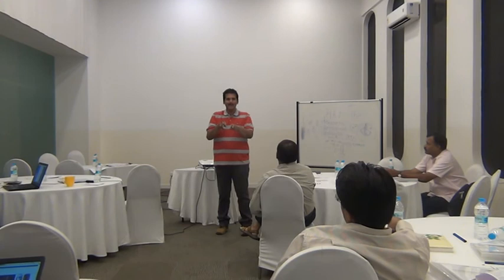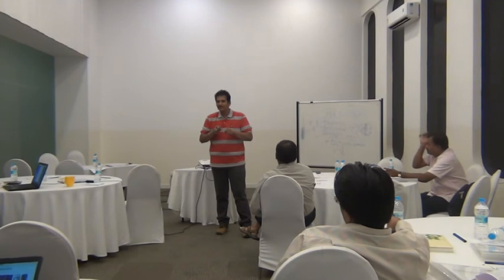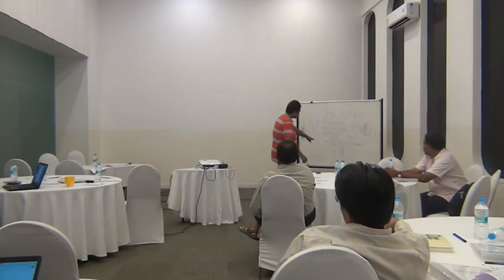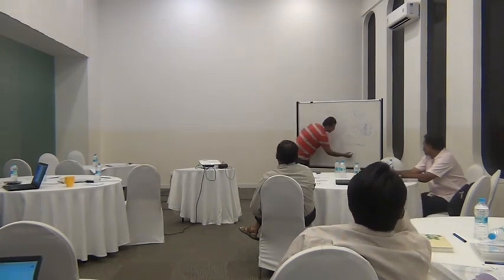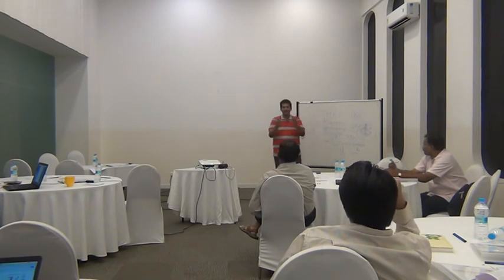Suppose there are two cars going in a race. One person is very hungry, another person is having a burger. The person in one car can give the burger to the other person when both are at the same speed. When both are at the same speed, the burger can be shared. So, if you want to move this proton, it has to be given some extra energy. So you send another signal, called an RF signal, at the same frequency as that of the original signal. Like the sharing.